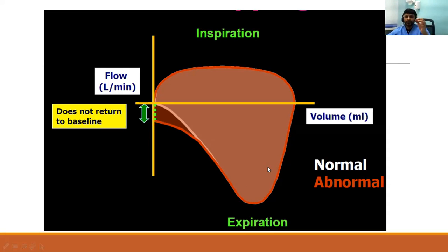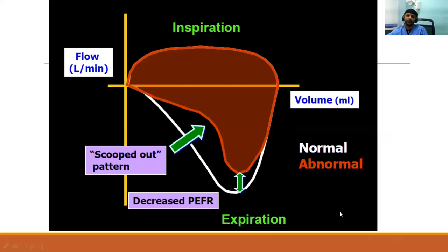Like the moment you have a baby crash on a ventilator, when you do look at this graphic, if the graph is showing this way, it probably should worry you for a pneumothorax, and thereby we should investigate accordingly.